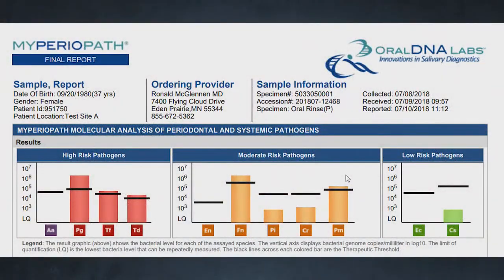First is the oral DNA test. This test determines the type and quantity of periodontal disease bacteria in your mouth. You spit in a cup, we send that bacterial sample out to the lab, and we find out what bacteria is growing there. If we find that you have one of the aggressive types of bacteria, we'll prescribe an appropriate antibiotic to help kill that bacteria that's lodged in your gum tissue. This step will help you to avoid periodontal surgery and laser treatment.